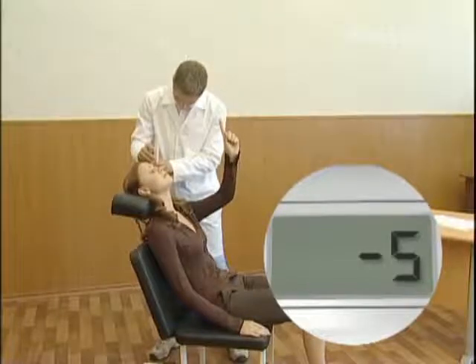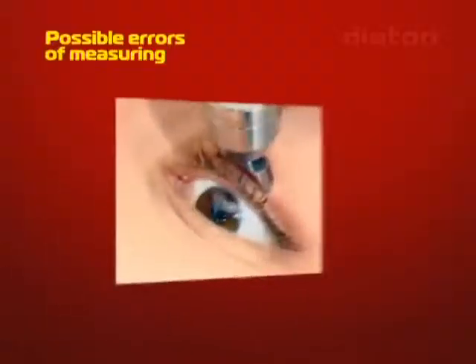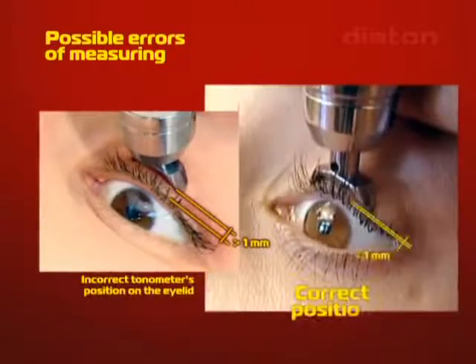During intraocular pressure measurement with the tonometer, some typical mistakes are possible. Mistake: Incorrect tonometer position on the eyelid — the tip is placed more than one millimeter behind the ciliary edge, or is not placed tightly to the ciliary edge. Correct method: The tip should be placed up to the front rib of the upper eyelid without touching the eyelashes.